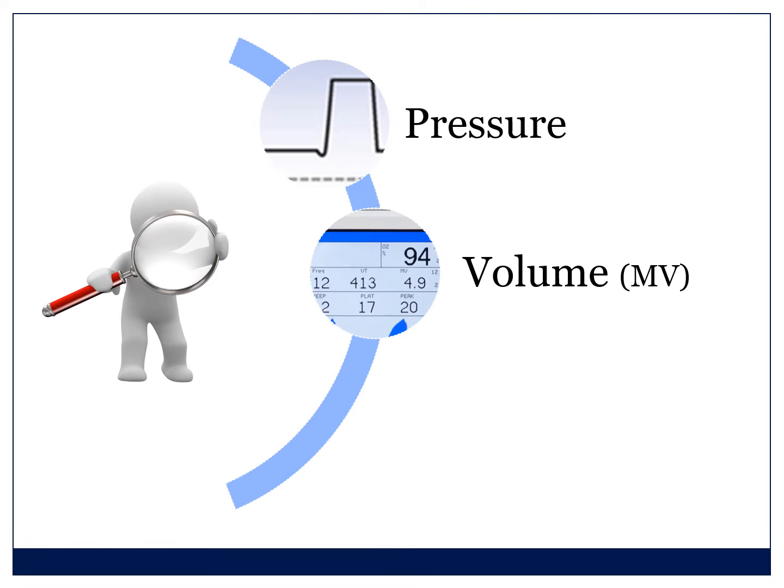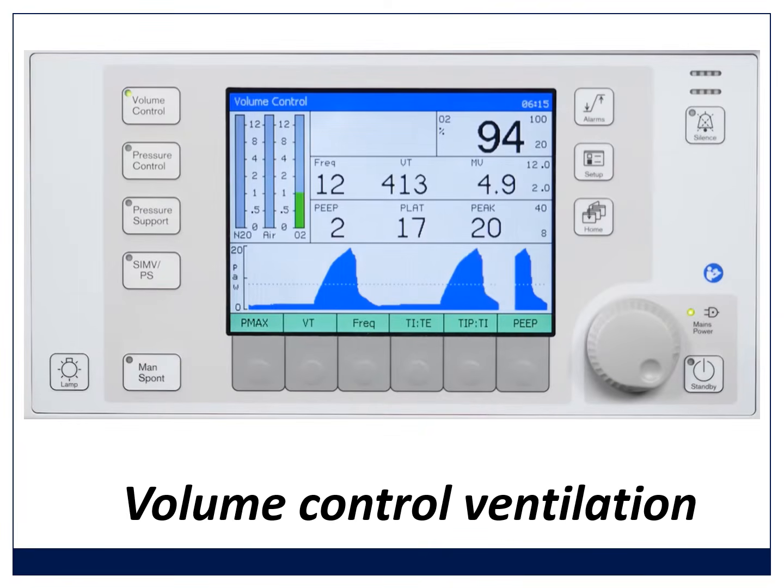I'm always glancing up at the ventilator, checking. And then watch, are you oxygenating well enough? And watch what's happening to the carbon dioxide, the end tidal carbon dioxide. That is a very good monitor of what your minute ventilation is. So CO2s that are either drifting down or drifting up are often telling you something. So continually evaluate the efficacy of the ventilatory parameters you've set.